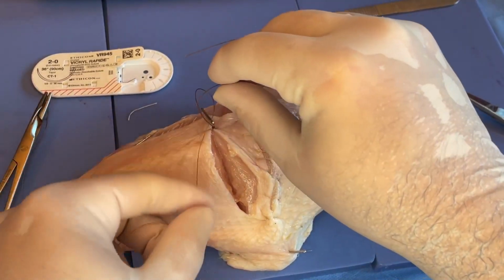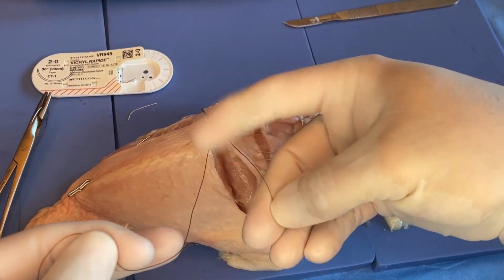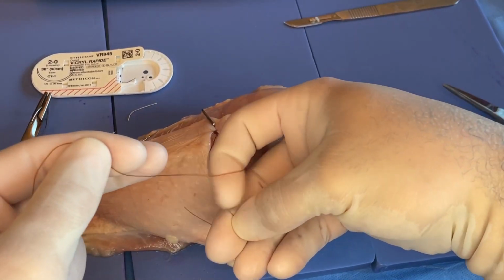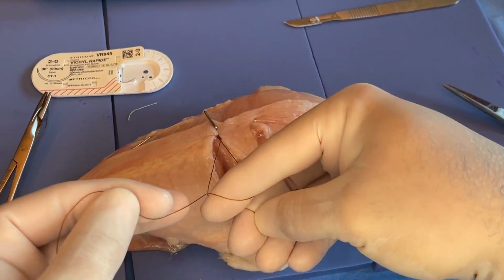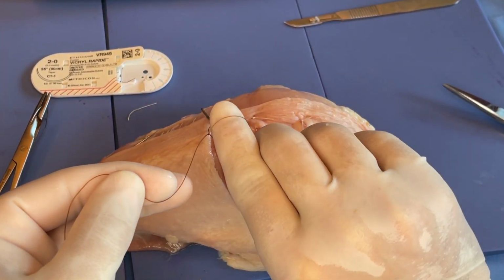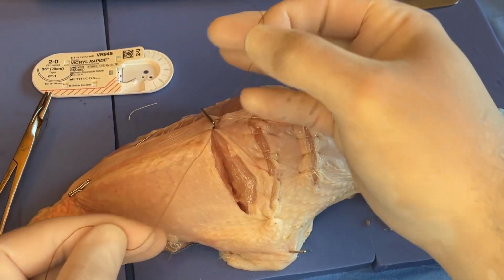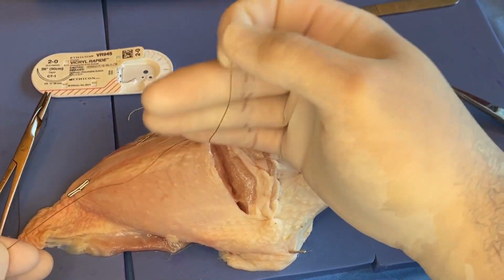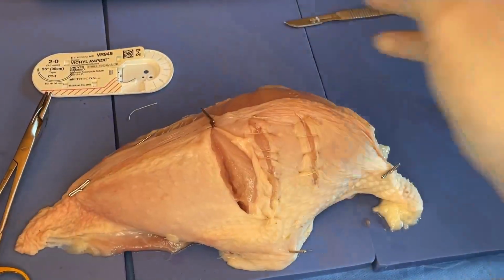It's always within your grasp, so to speak. And then with just the index finger here, loop over there, pull it through, rotate. Once you get that trapped, rotate your hand this way to get that up, and then come up, pinch it. Now I've got it, and go down, and then that sets you up being ready for the next over those fingers again.